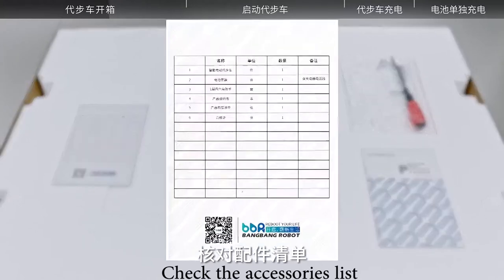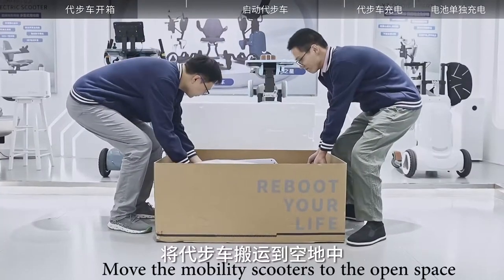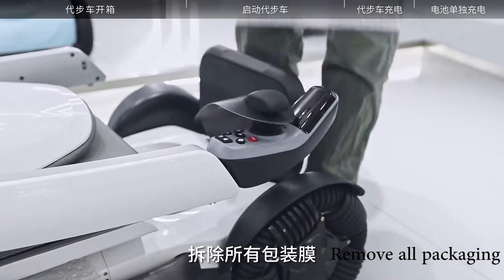Check the accessories list. Remove the foam cover. Move the mobility scooter to the open space. Remove all packaging.